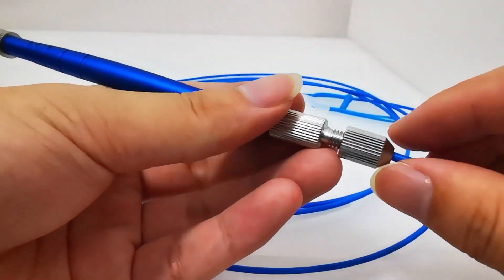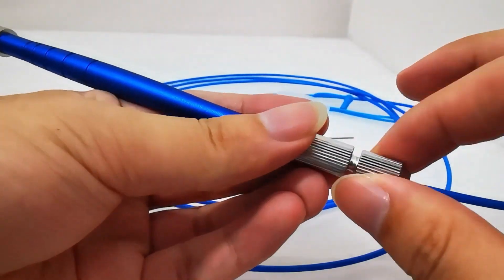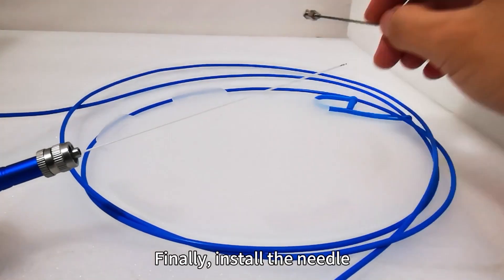Just tighten it. Finally, install the needle.